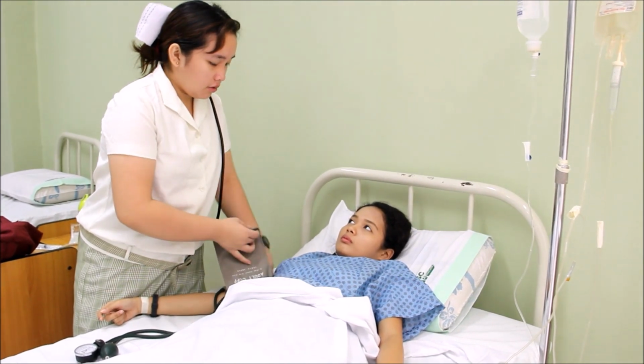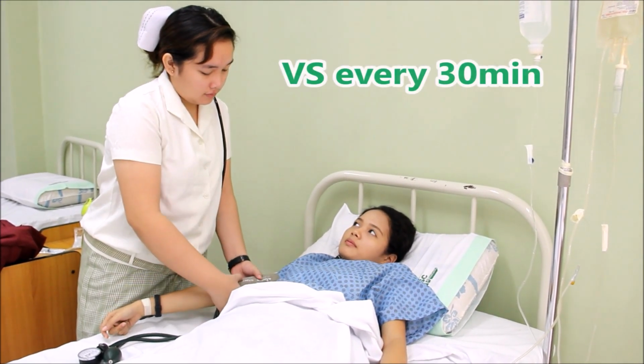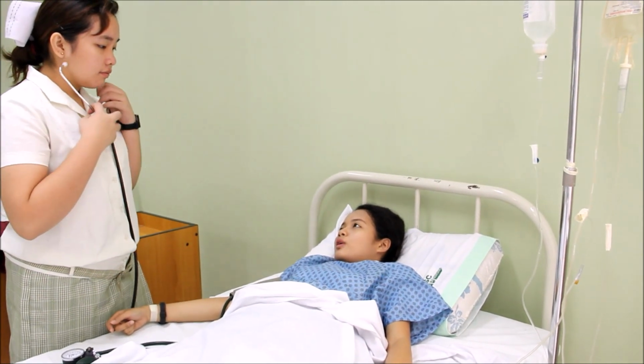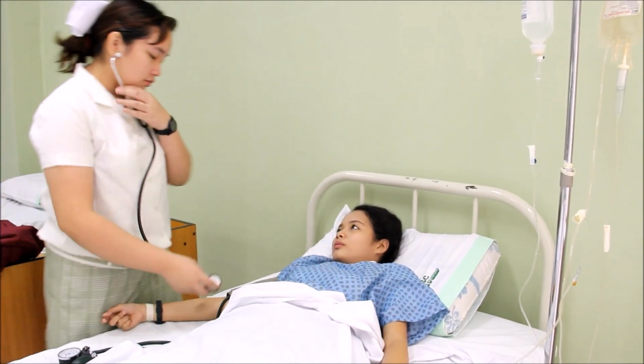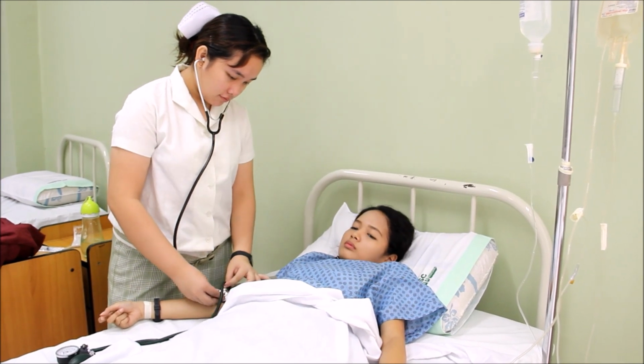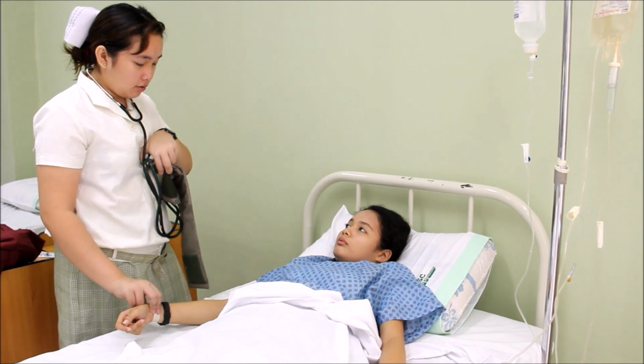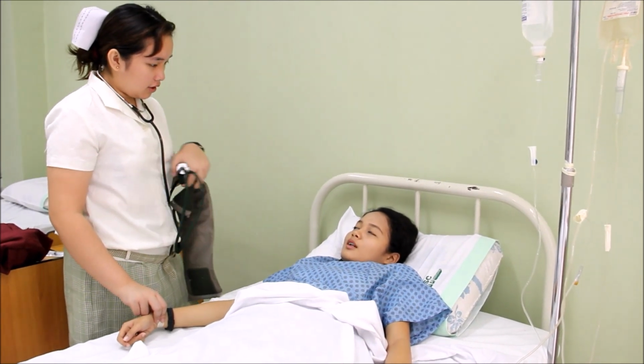Assess the client including vital signs every 30 minutes or more often, depending on the health status, until 1 hour post-transfusion. If the client has a reaction and the blood is discontinued, send the blood bag and tubing to the laboratory for investigation of the blood.